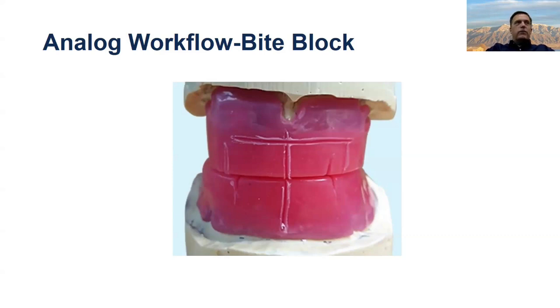I feel like bite blocks are one of the underutilized features in dentistry. When your laboratory gets the bite block, basically what they're going to try to do is set the teeth so that the buccal surfaces of the teeth are aligned with the buccal labial surface of the wax. So if you shape up the wax so that the buccal corridor looks good, the lip support is good, all that stuff, you'll find that all of a sudden your setups get a lot more predictable. So a little bit of time spent contouring the bite blocks can give you much better results for your setup. And that's the case whether you're doing a hybrid digital workflow or a traditional analog workflow.